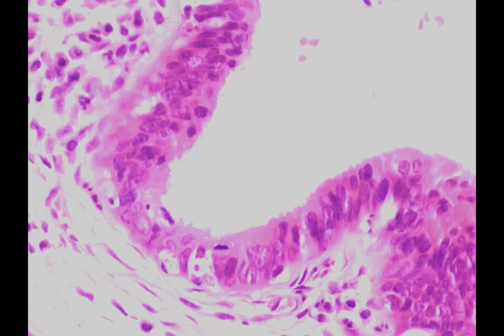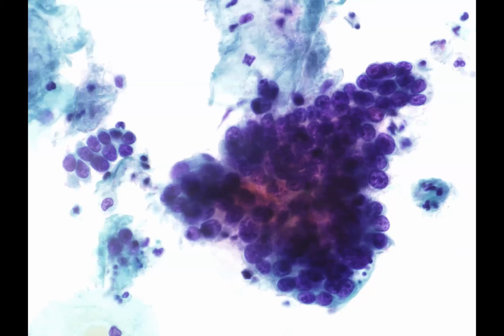Now back to our H&E. We've got an area of high-grade CGIN here. We've got nuclear elongation and variation in chromatin. We've got mitotic figures, as you can see here. But I also want you to see this material, which is apoptotic debris that we very commonly see on H&E. You can also see it cytologically. So once again, we have our abnormal supercrowded endocervical groups, our abnormal chromatin, but this photomicrograph is taken to show you these little black specks here, which is apoptotic debris.